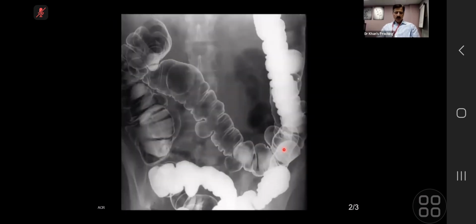Now, this is what we were talking about. That film was decubitus. Here you can see these pseudo-sacculations. Now, what happens? This is what we call hide-bound bowel, just like skin, you can have hide-bound bowel in scleroderma.